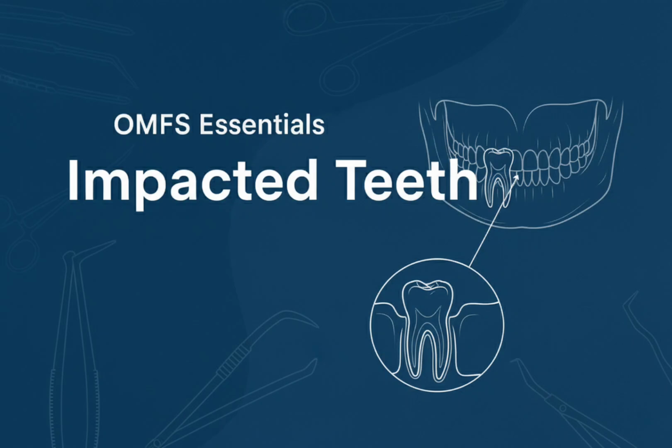Chisel and mallet. This method is less preferred as it can cause patient anxiety and risks splitting the bone. If used, 2 vertical stop cuts must be made first to prevent the split from traveling along the bone grains. Osteotomy technique. Distobuccal gutter. Bone is typically removed distobuccally to expose the crown up to the cemento-enamel junction. This creates the distobuccal gutter and facilitates elevator placement.